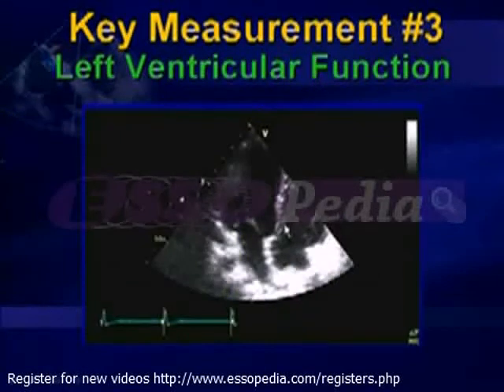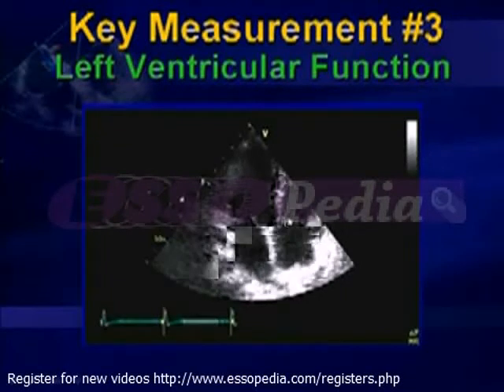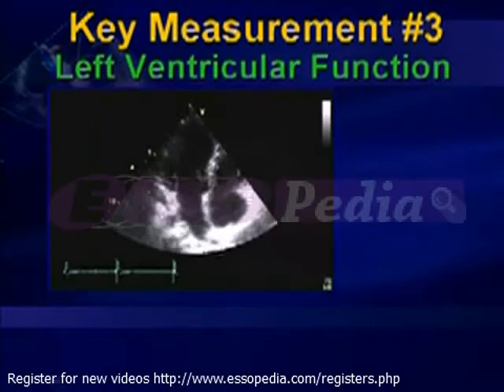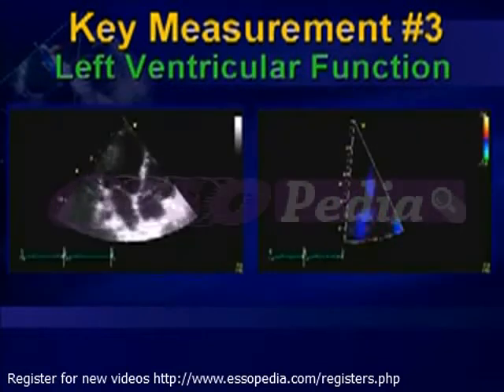And then, in particular, in those with a normal left ventricular ejection fraction, using Doppler tissue imaging, ventricular function may be characterized through the evaluation of myocardial velocities.